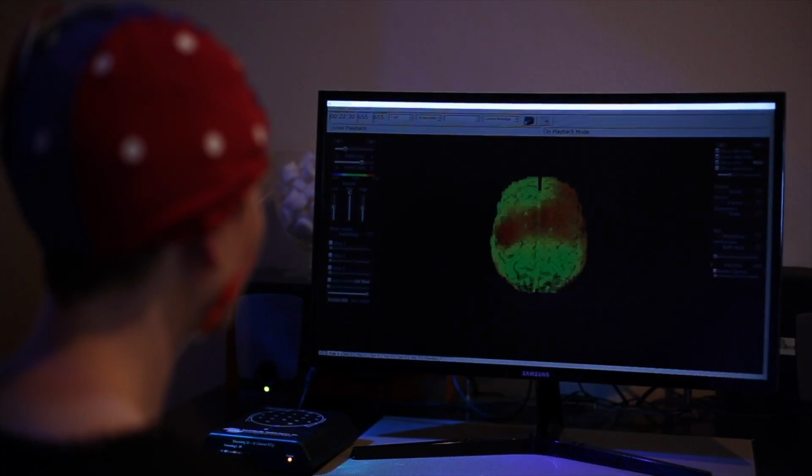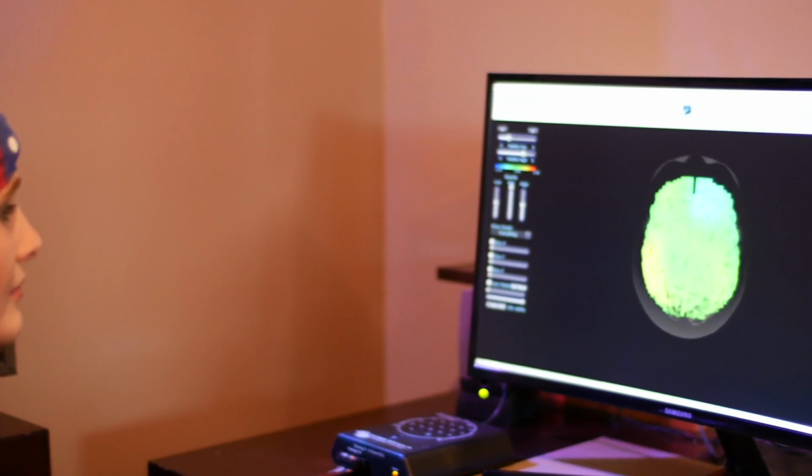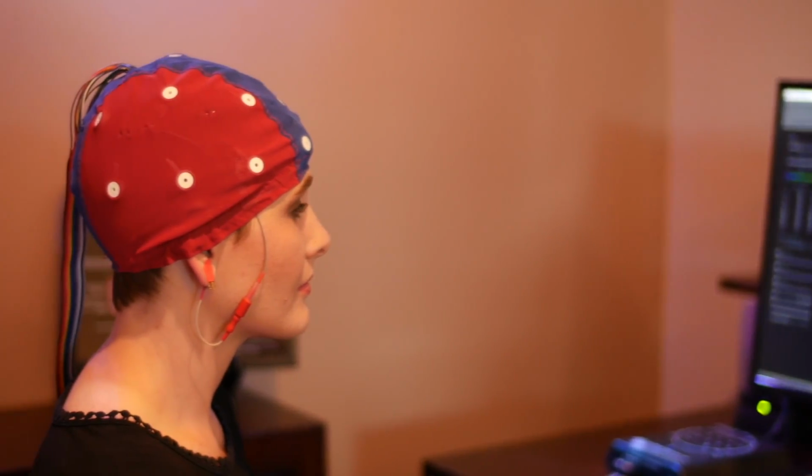That whole process. And then if you're going in office, you go in once, twice a week until symptoms alleviate. Some people only do 20, and sometimes those people end up coming back later on. But if you do more than that, say if someone does 50, oftentimes they don't need to come back. That learning's there. So that's what to expect with a QEEG, what the process of getting one looks like, and determining if you are a good candidate for neurofeedback.